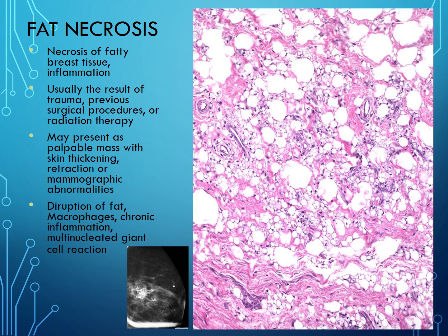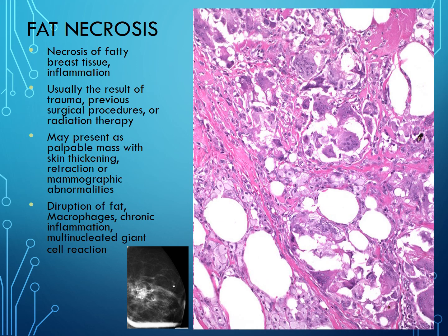Fat necrosis is another mimicker of malignancy — it's benign. This typically happens with trauma: fat cells die off and macrophages come in to clean up the mess. On low power you see residual fat cells with macrophages eating the debris. On higher magnification you see multinucleated giant cells (histiocytes) and foam cells — histiocytes filled with lipids as they eat up the dead fat cells.